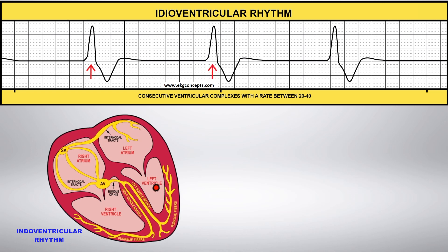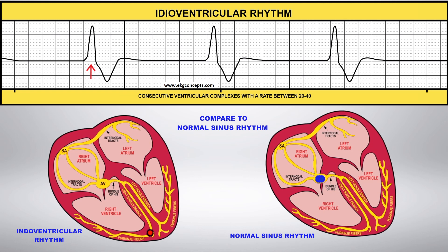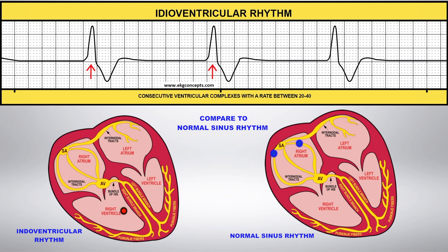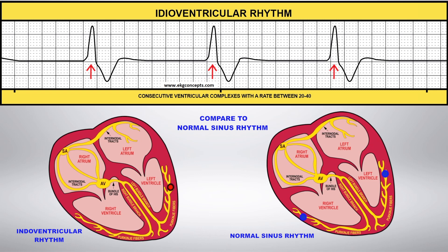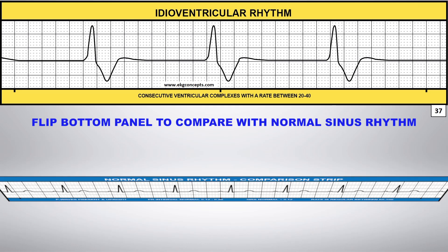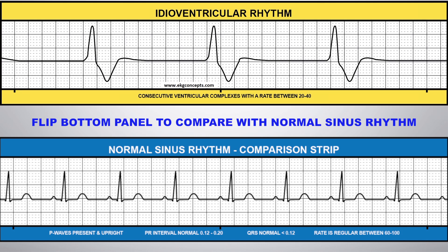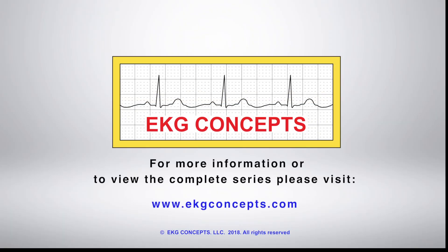Here, the ventricle is initiating a final attempt to produce an impulse. Compare this to normal sinus rhythm. You can flip the comparison strip on the bottom panel to compare this rhythm to normal sinus rhythm.